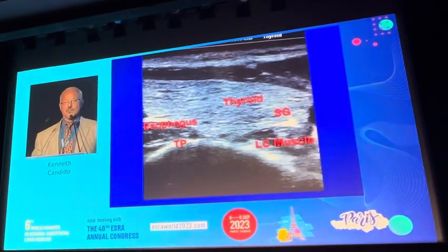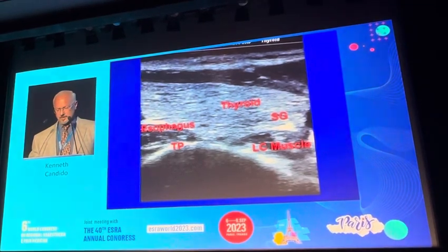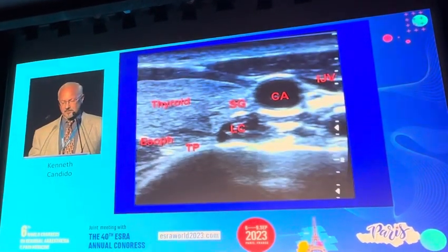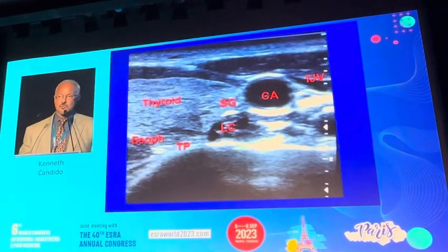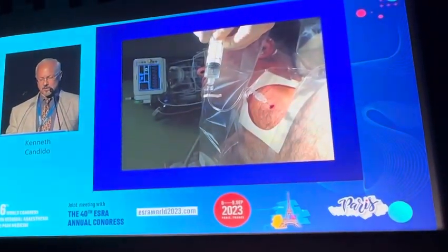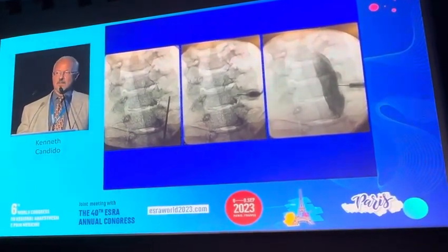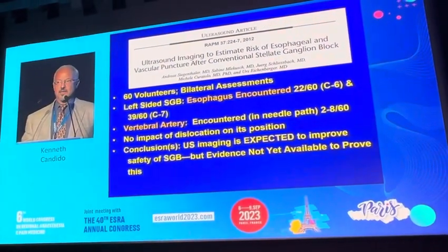We realized we did thyroid biopsies on virtually every stellate ganglion block we ever did until the advent of ultrasonography. You can see the longus colli muscle, which is a target for our needle placement in the hyperechoic structure of the stellate ganglion, as well as the vascular structures, which, as the previous speaker mentioned, you do not see when you're using fluoroscopy. And here's the technique and the approach: our needle will be placed from lateral to medial. Whereas with fluoroscopy, of course, we have the advantage of seeing the osseous structures to a greater degree. So is there any benefit for the use of ultrasound versus fluoroscopy?